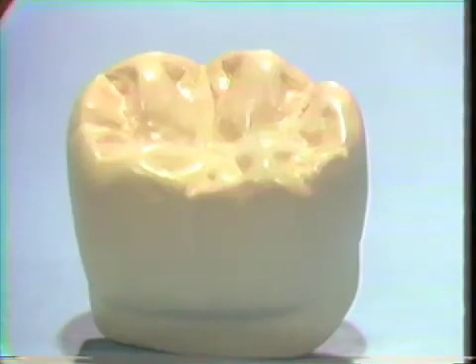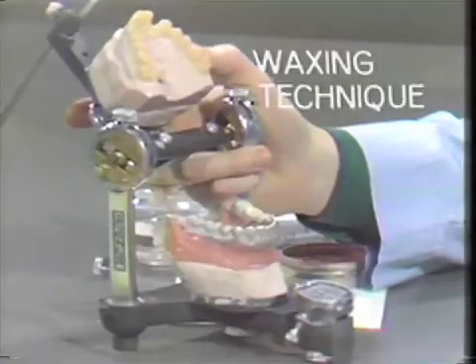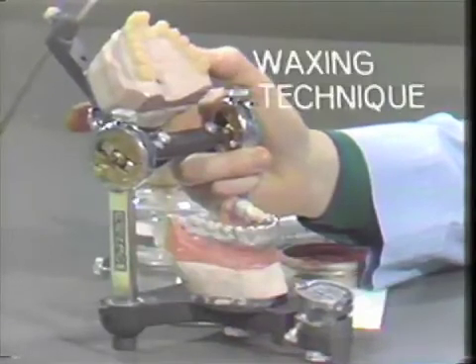This you can see as a logical way to start with the supportive, non-supportive, marginal ridges, triangular ridges, and on through the occlusal development, ending up with a harmonious occlusal anatomy which will be acceptable to the dentition. We are now ready to begin developing our wax pattern.